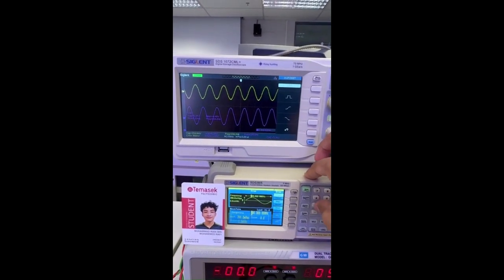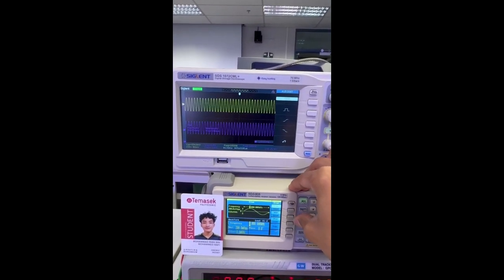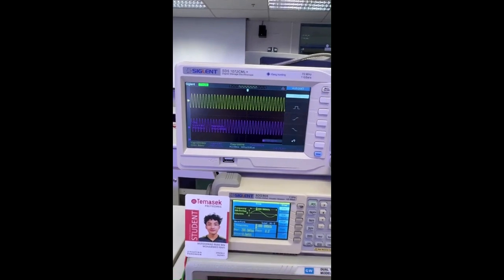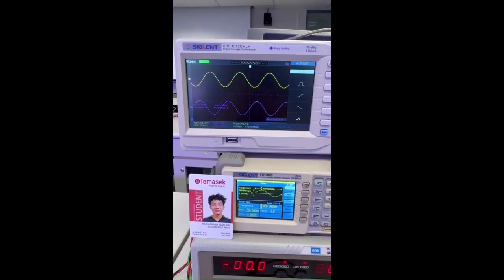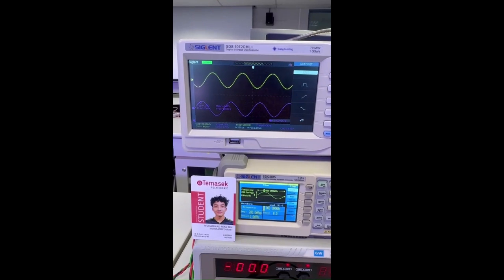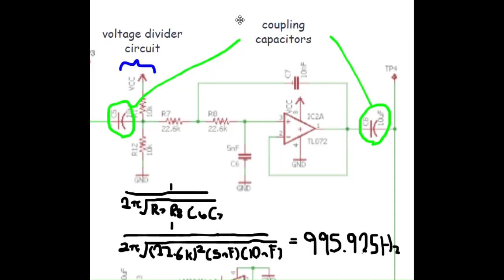This is at 200 Hz. I adjust it to 1 kHz just to see how different frequencies affect the waveform. So over here I get voltage peak to peak 4.08 volts, and yeah, that's my measurement of TP3. The third block shows a Sallen-Key second order active low pass filter.